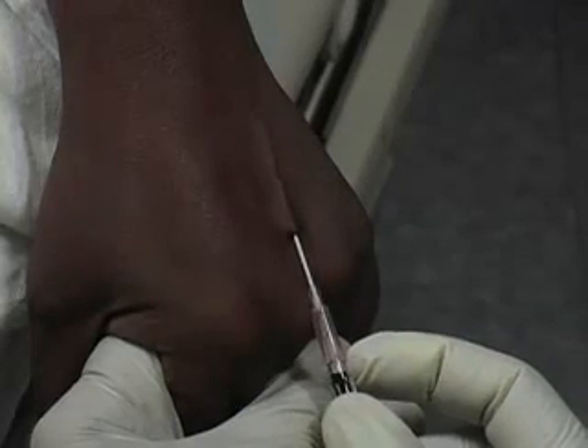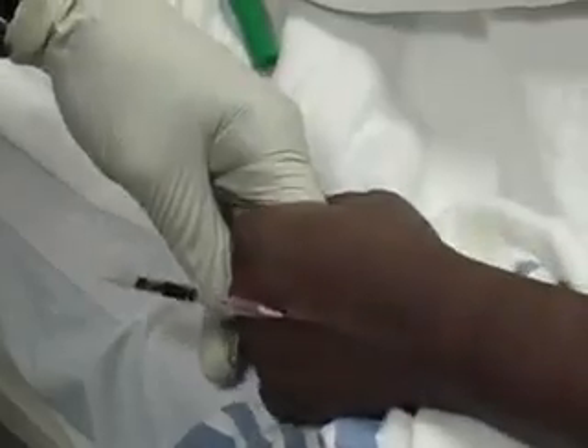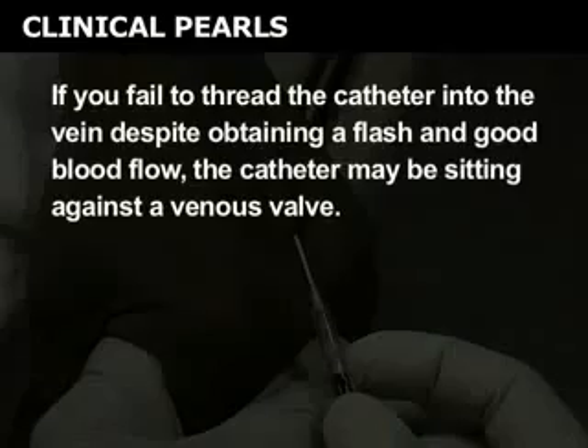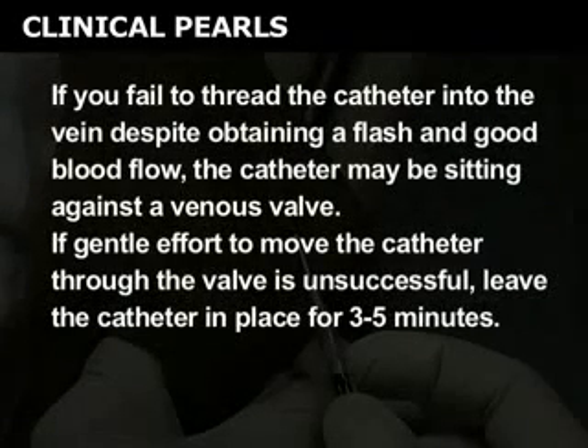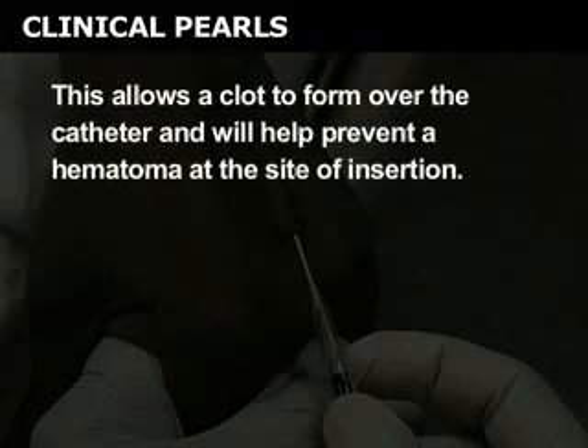Gently push the catheter forward while holding the needle steady with your thumb and middle finger. Blood should flow freely into the catheter if it is correctly placed. If you fail to thread the catheter into the vein despite obtaining a flash and good blood flow, the catheter may be sitting against a venous valve. If gentle effort to move the catheter through the valve is unsuccessful, leave the catheter in place for three to five minutes. This allows a clot to form over the catheter and will help prevent a hematoma at the site of insertion.